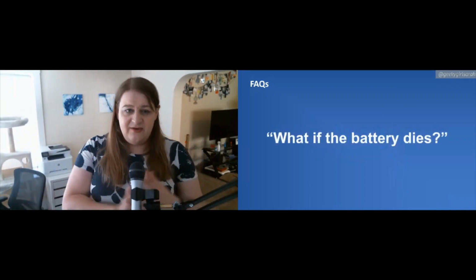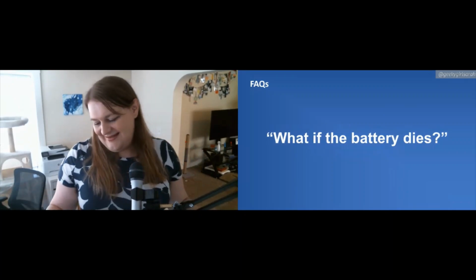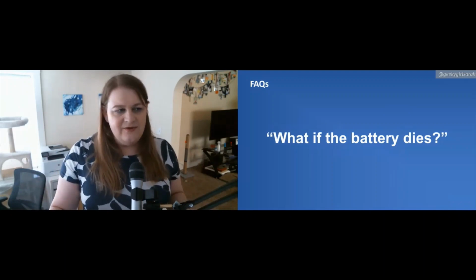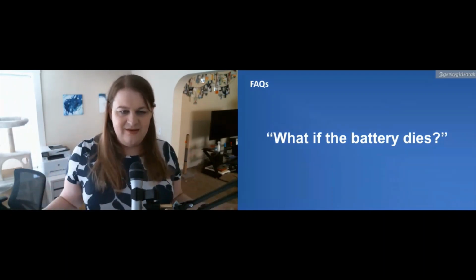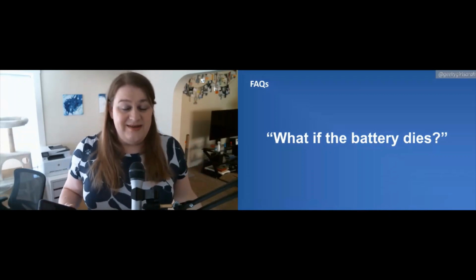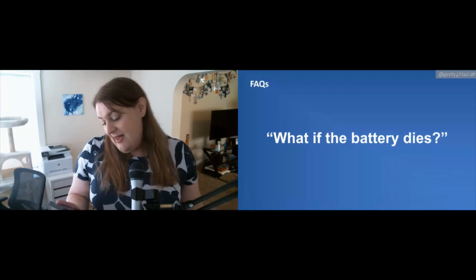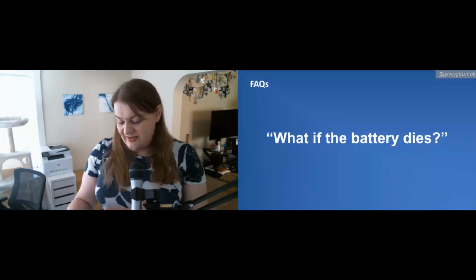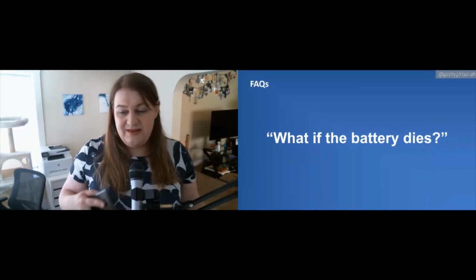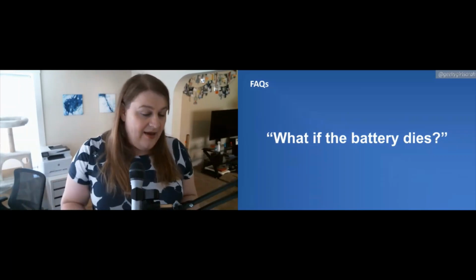What if the battery dies? Yep, because your pancreas can die. So if this dies, it goes back to manual mode. So my pump doesn't loop. It just gives its default dose anymore. If the battery on my phone dies, I don't know what my glucose is, so I have to charge that. I always carry a battery pack with me now. But if the device dies, then I just see my glucose values, but it's not looping. There's no automation to it. So I would have to manually control this.